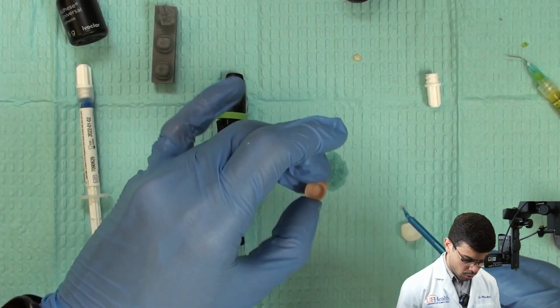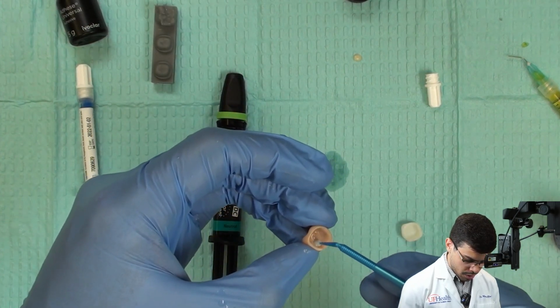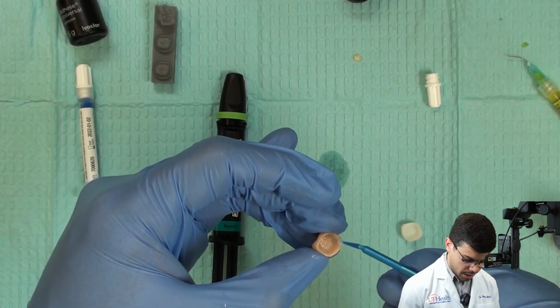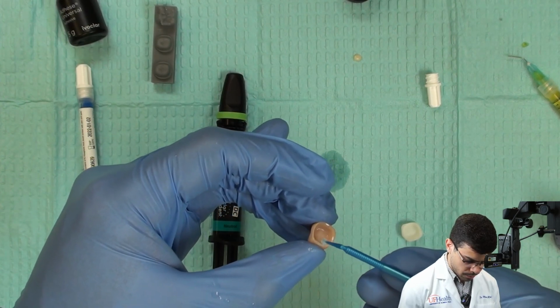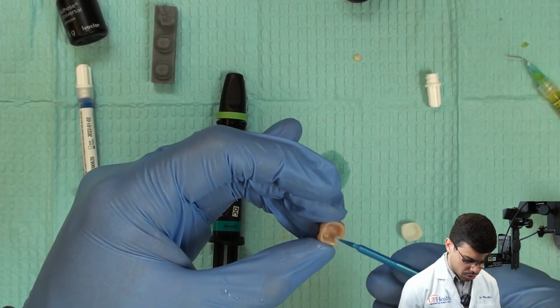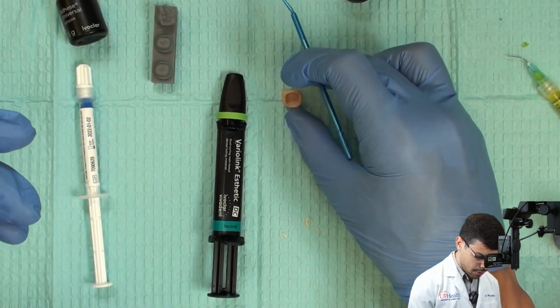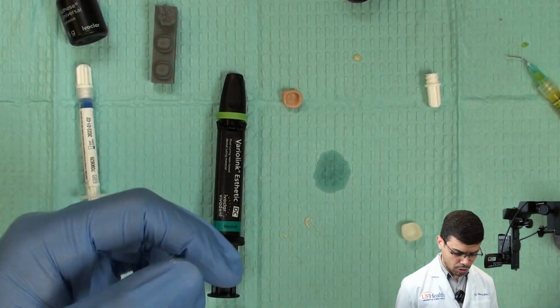This is enough. You don't want to have a very thick layer of monobond, okay? So now you're gonna apply. You don't have to scrub very hard. You just need to make sure that it's in contact to everything, and then you let this sit aside for 60 seconds. This will evaporate the solvent.